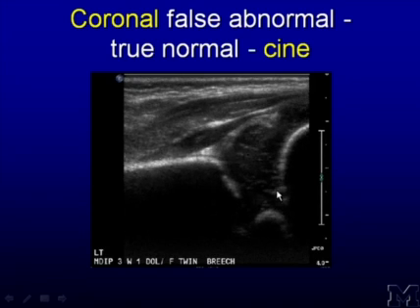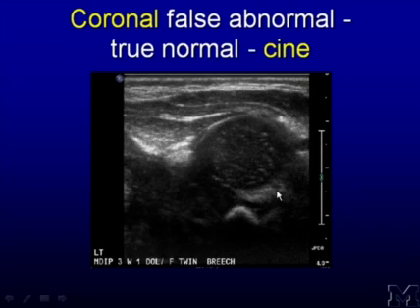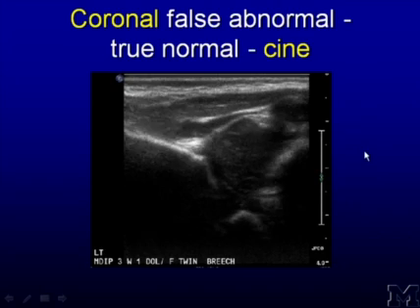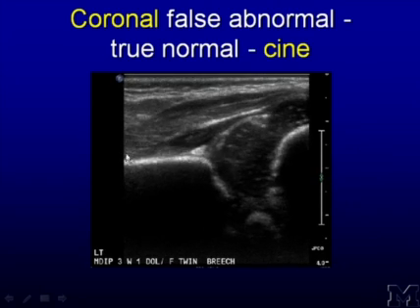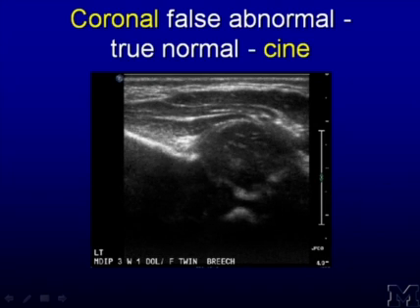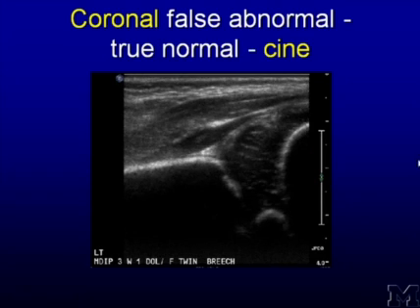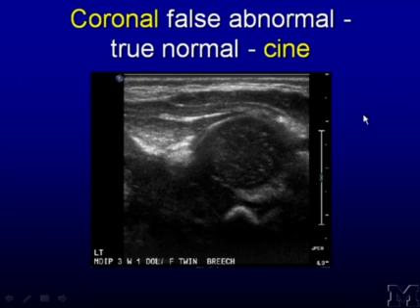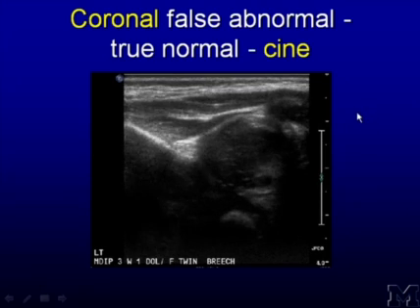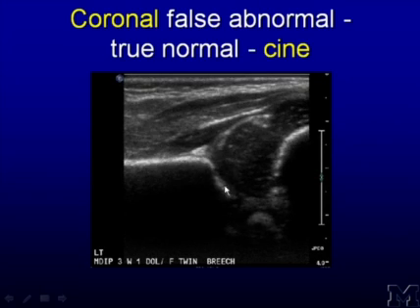One is regarding the transducer if it's not aligned properly, so that you really are seeing the true coronal standard plane. What I'm showing you here, this was done intentionally, is that at the beginning of the loop, this is normal right there. Nice acetabular roof, lateral aspect of the ilium, the ball's in the socket. But if you have the transducer tilted or turned or transposed a little bit incorrectly, it's almost like flying a plane, which you have pitch, yaw, and roll. All these things can happen to the transducer with respect to the lateral aspect of the body.